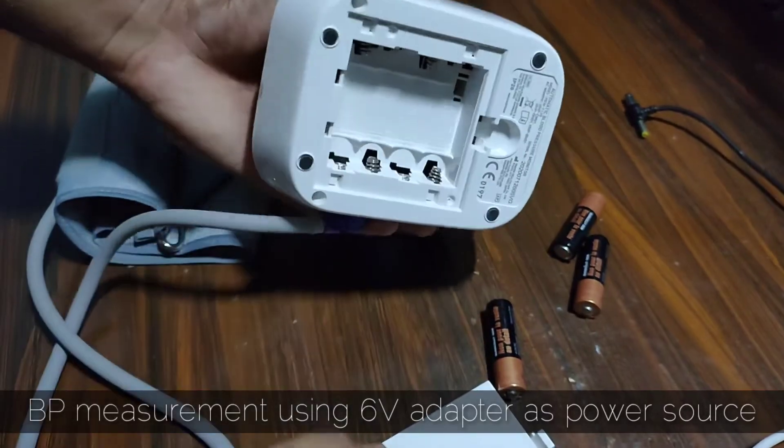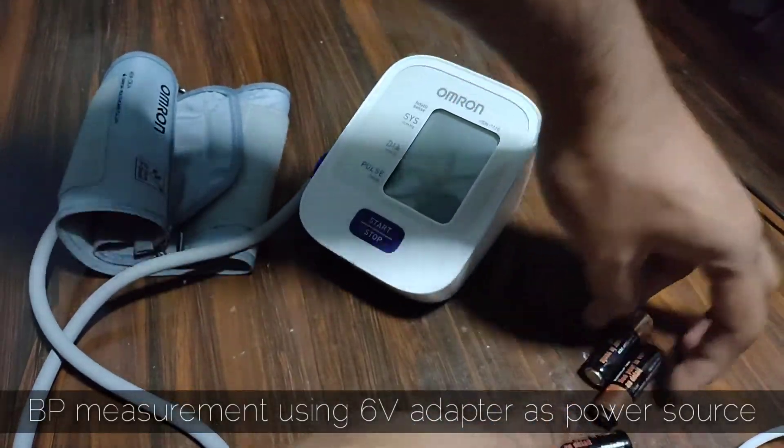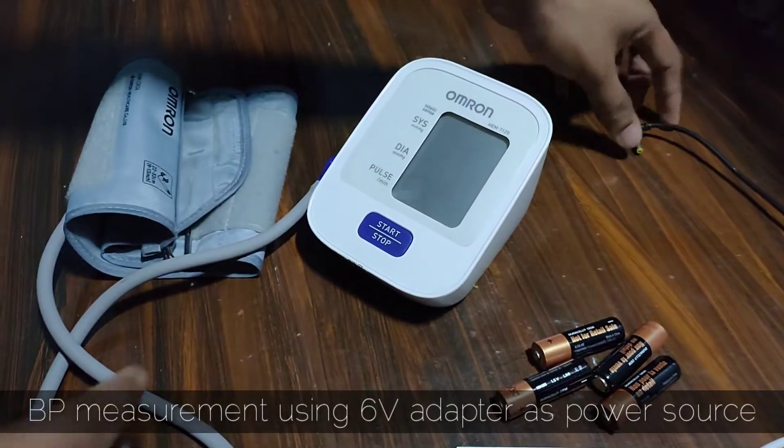In case you run out of batteries, this BP monitor can also be powered using a good quality 6V adapter.